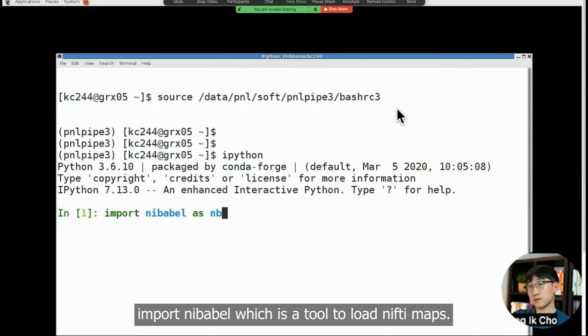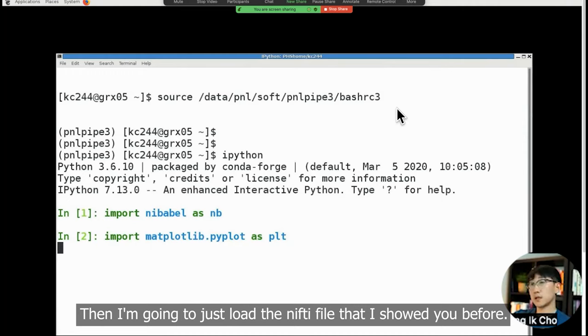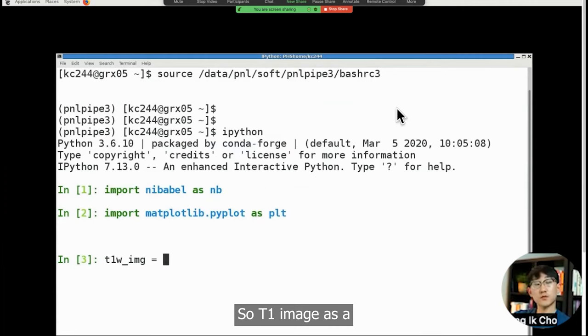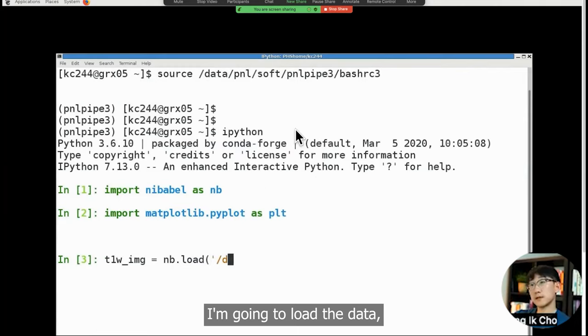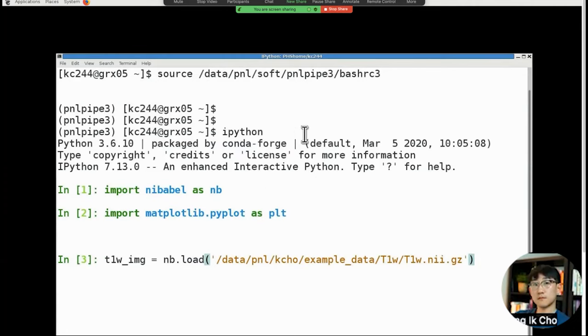Then I'm going to import matplotlib library, which is the graph function in Python. Then I'm going to just load the nifty file that I showed you before. So T1 image, I'm using the nibabel module. I'm going to load the data which is in kcho example data and T1 weighted T1 weighted nifty. The whole point of doing this is just to show you the numbers in the stack.